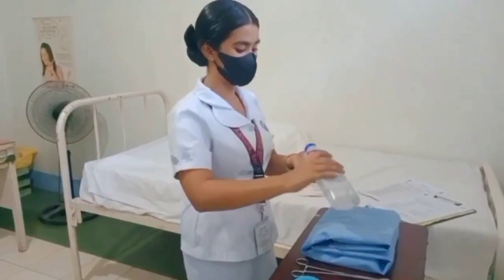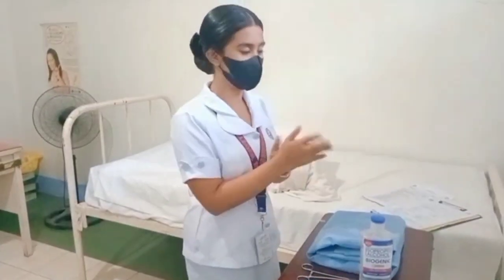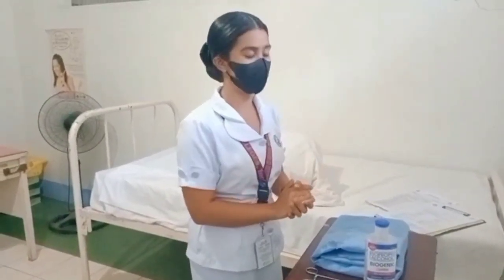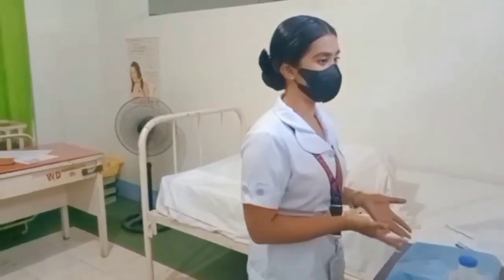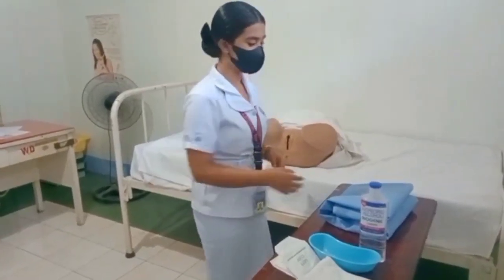Next, I'm going to wash my hands to prevent the contamination of microorganisms. And then the type of catheter that we are going to use is a Foley catheter, and it has a 12 to 14 French. And we will assemble all the equipment needed, including a catheterization set, a light source, and a bath blanket. This will open the catheterization set.